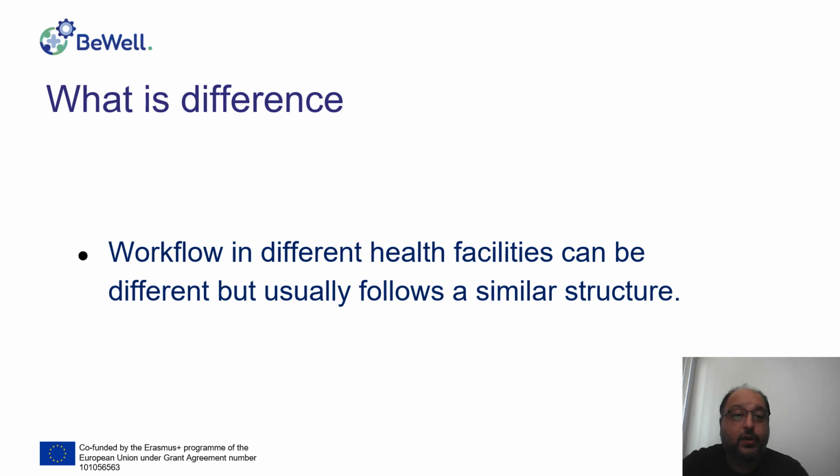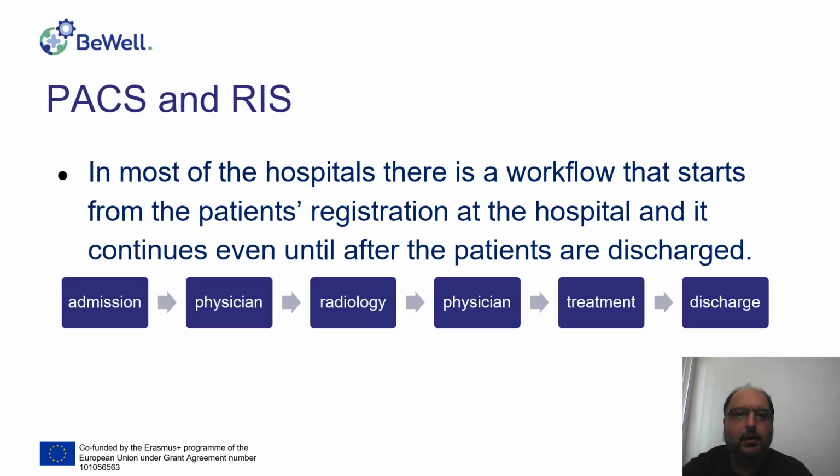The workflow is different in each hospital, in each healthcare facility, and of course the methods are somehow different, but anyway, their structure is quite similar. In most hospitals, the workflow starts with patient admission, then the patient is examined by a physician.